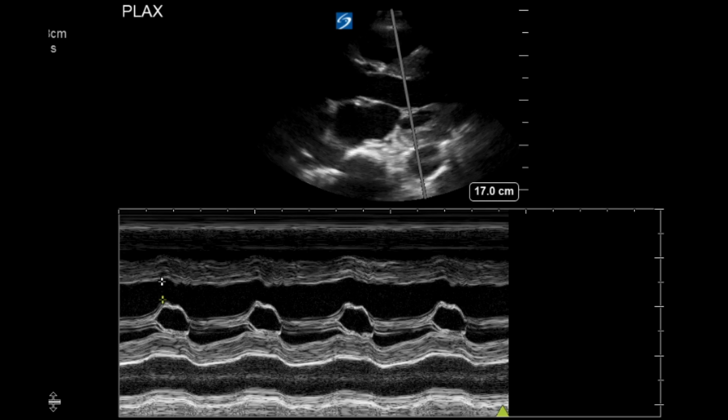Right. So in a normal healthy heart, the mitral valve should be almost making contact with the septum, and sometimes you don't even need to do this if it's very clear that the mitral valve is hitting the septum each time. But if you take a measurement and it looks bigger there, you can quantify that. So less than 7 is normal. Between 7 and 14 millimeters is moderately reduced, and greater than 14 is severely reduced. So this patient is 15 millimeters, which puts this into more probably the severely reduced ejection fraction category.